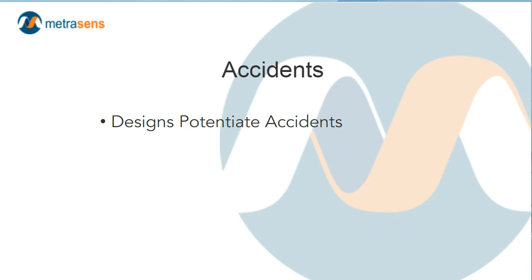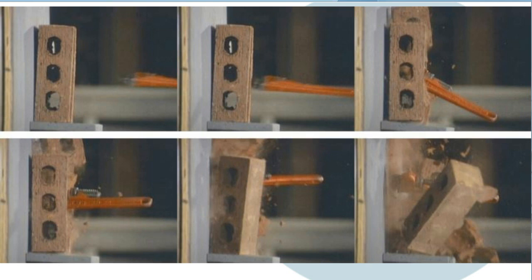Probably the best known, most widely recognized risk in MRI is the likelihood that the magnet is going to draw something to it. In this webinar, it's difficult to show videos, so I've created a little stop motion collection of images, individual frames from a video that show a pipe wrench.